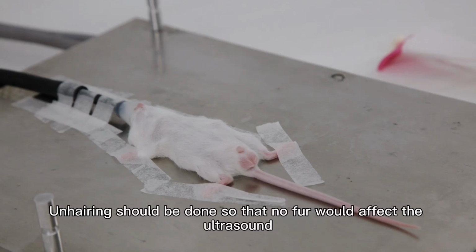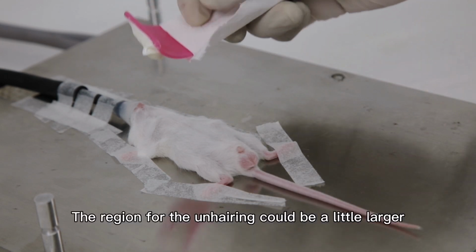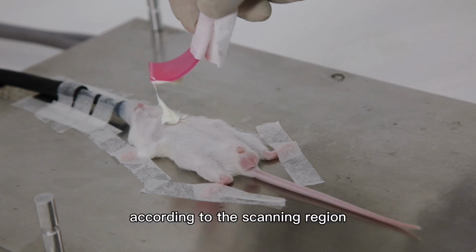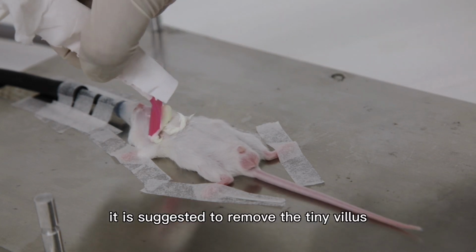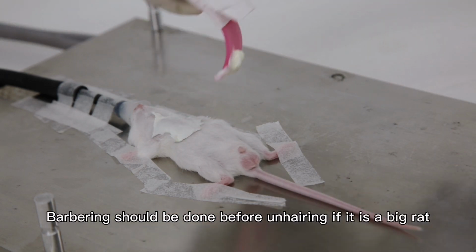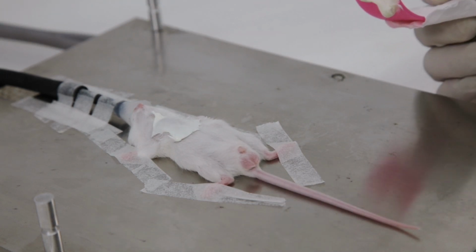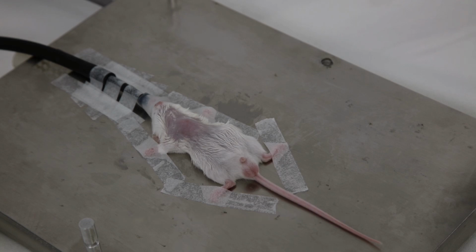Unhairing should be done so that the fur will not affect the ultrasound. The region for the unhairing could be a little larger, according to the scanning region. It is suggested to remove the tiny villi. Barbering should be done before unhairing if it is a big rat. Clean off the depilatory with fresh water in order to protect the probe.